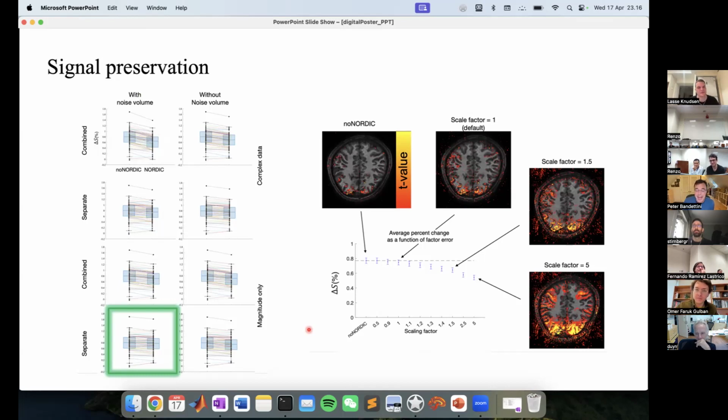I actually don't know for sure. Those are frontal eye fields. Just a thought that it might actually not be. It would be interesting also to see, if you keep on going, the percent change go down to 0, and then what does the contrast to noise map look like?